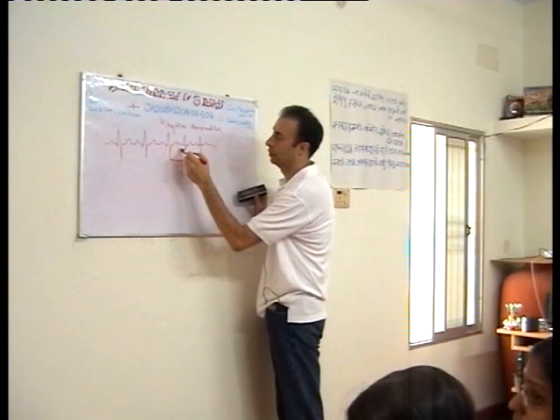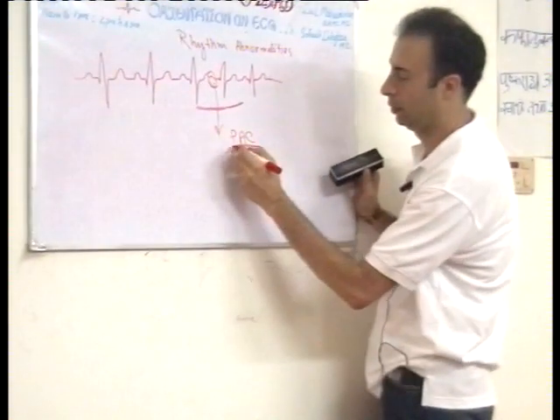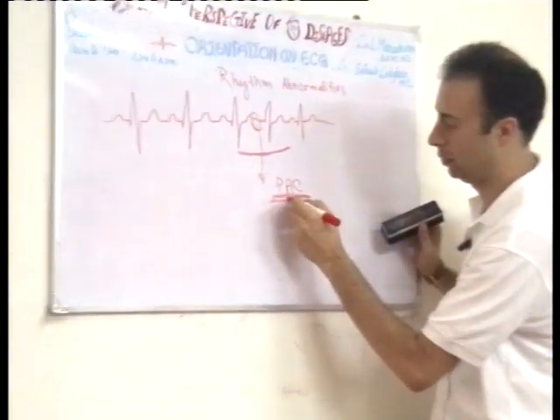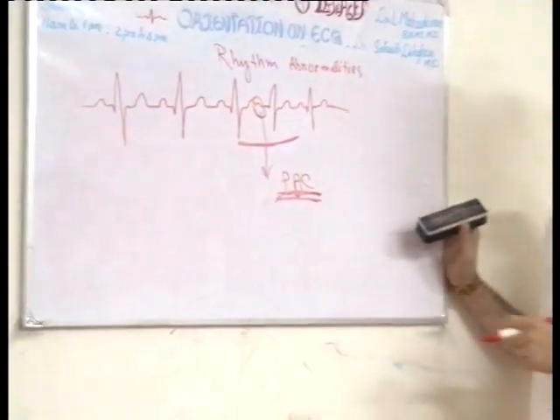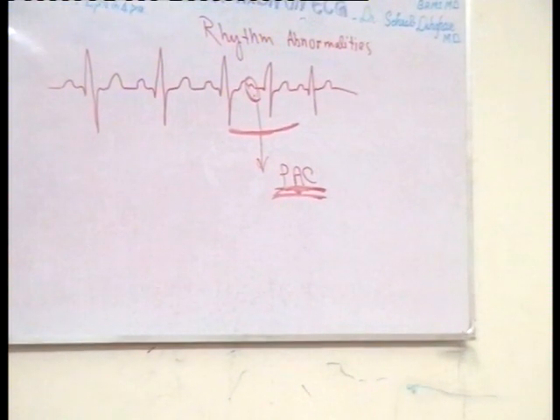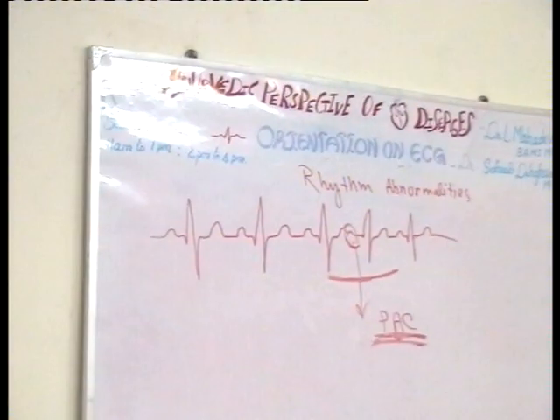But this you can learn. Even for an experienced hand, this is very difficult to find easily, I tell you. Many times I missed it. Even for my father I missed it. Very difficult. Isn't it, sir? Yes, it is a little bit difficult to understand premature atrial contraction.